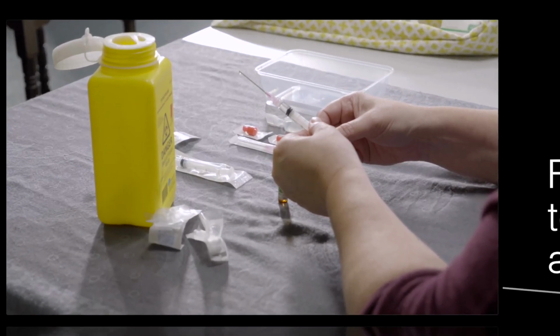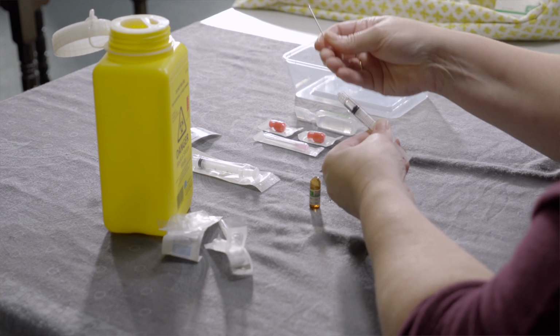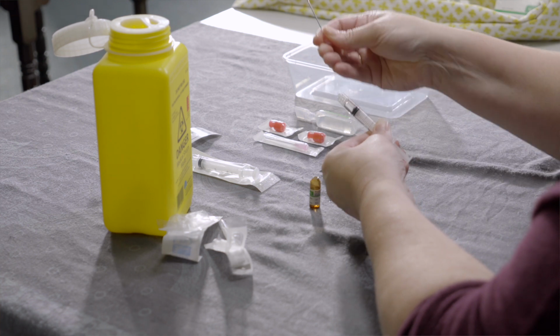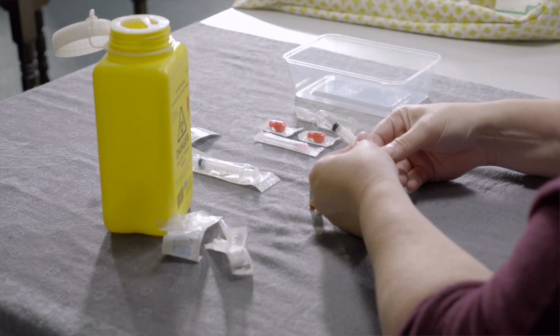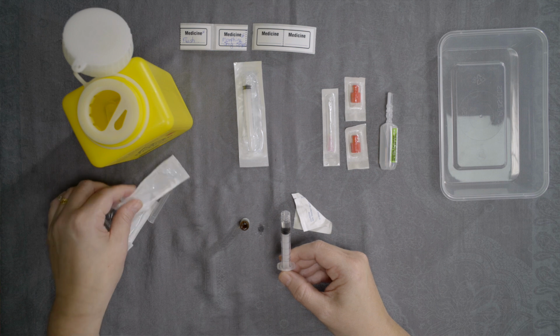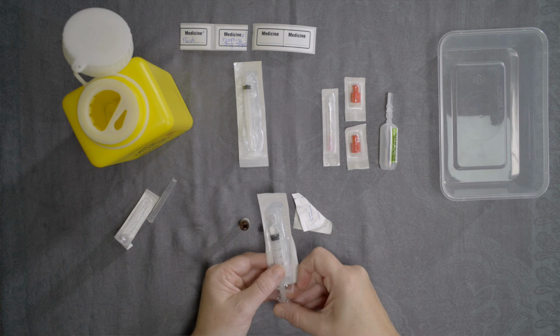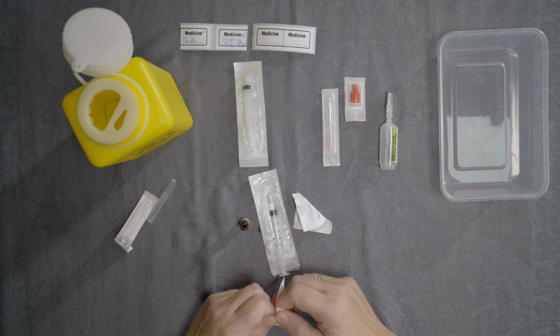You can now carefully remove the needle from the syringe using a twisting motion. You should never recap a needle. Instead, place it into your yellow sharps bin. If for some reason you do not have a yellow sharps container, speak to your palliative care service. You can then place the syringe back into the packaging to keep the end clean until ready to use. If you have been supplied with a cap, you can place this on the end of the syringe.